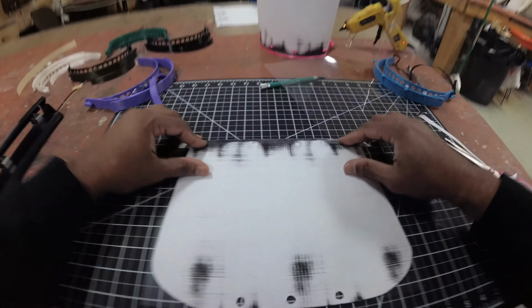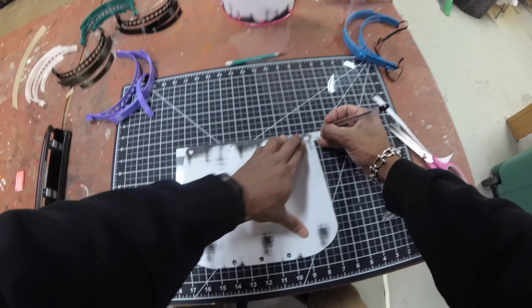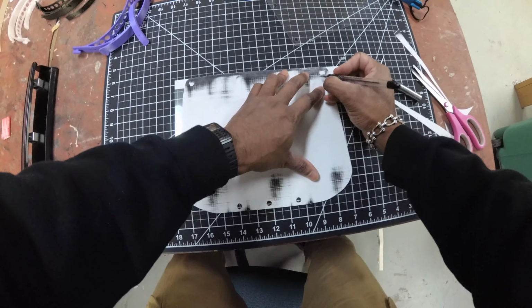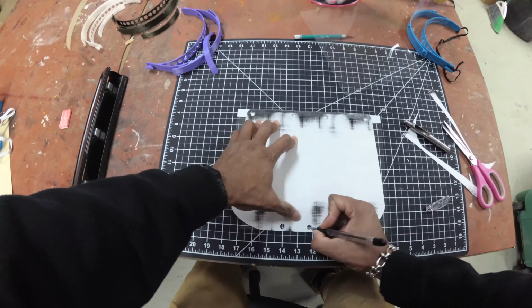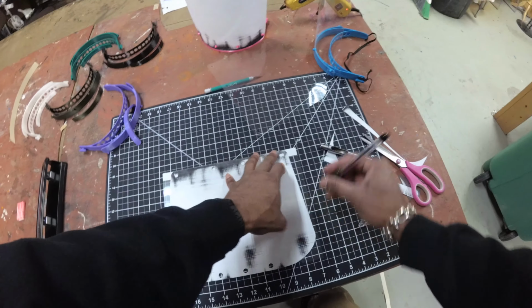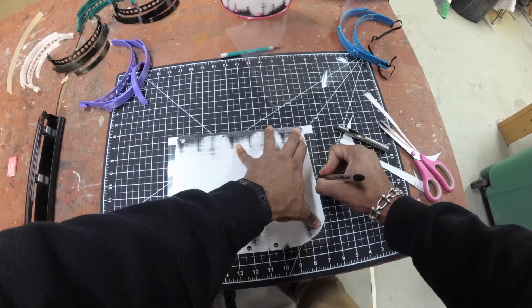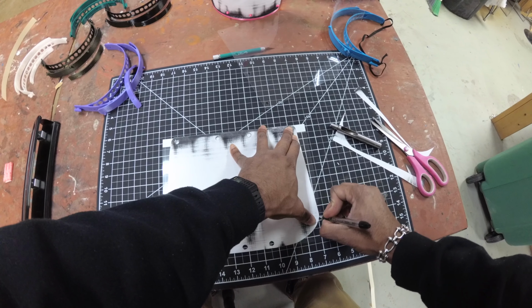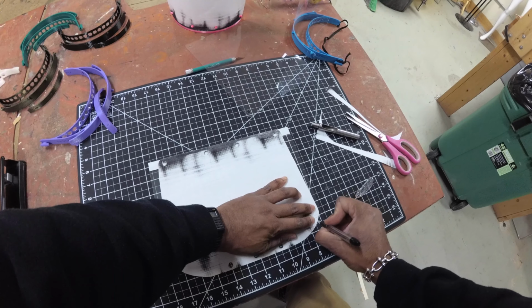Okay, I'm just going to place my piece down on the transparent sheet. You can grab a pen or a pencil or anything that can leave a mark. And the first thing I would do is start with the holes. And if your pen is not writing on your plastic, just press hard enough that it leaves a mark that you can see. That way, when you're ready to cut it out, you have some sort of indication of where it is that you need to make your cuts.